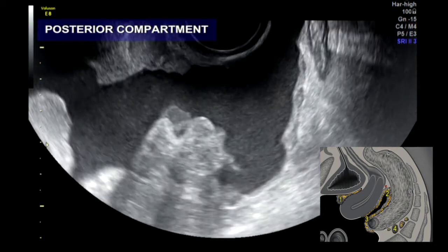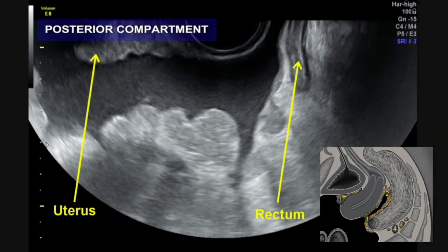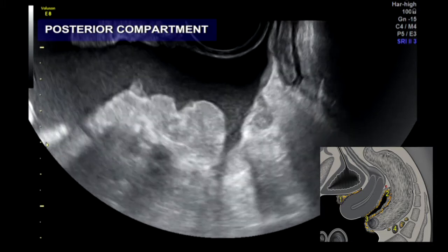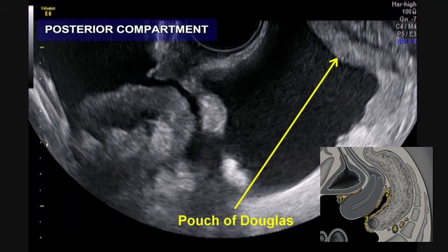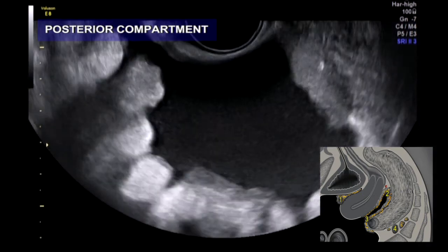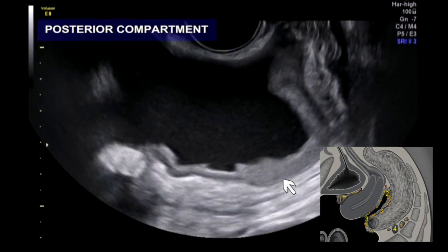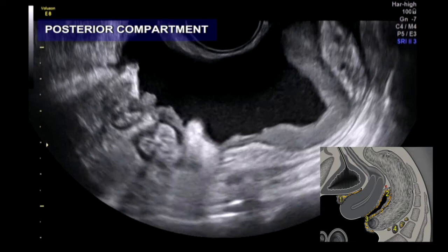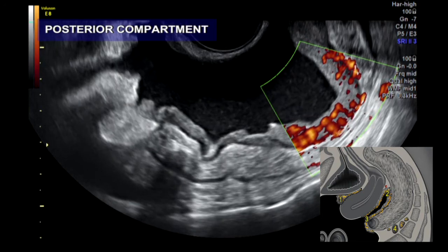Continuing towards the pouch of Douglas, you can see how the carcinomatosis is very thin but diffuse at the same time. Note that the tumor is not infiltrating the muscle layer of the rectum, but it is clearly visible that the carcinomatosis has infiltrated deeply the sigmoid colon with the loss of the hypoechoic muscle layer. This is visible here, and the carcinomatosis is highly perfused again.